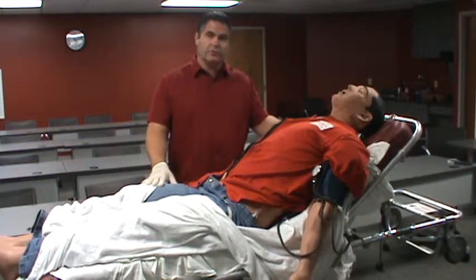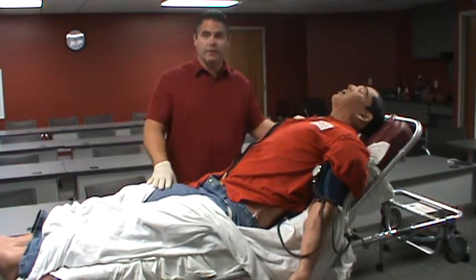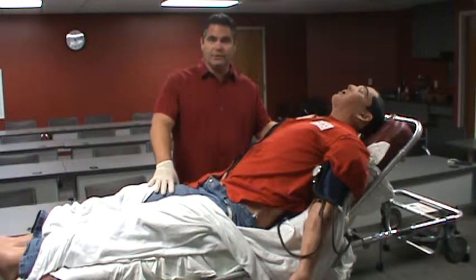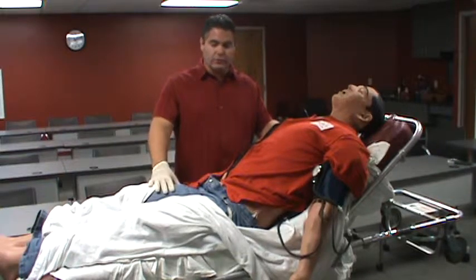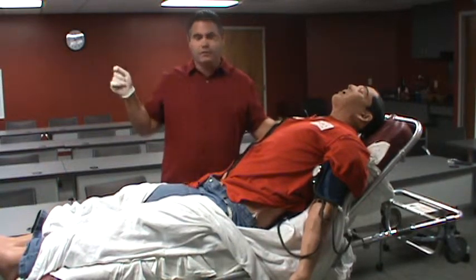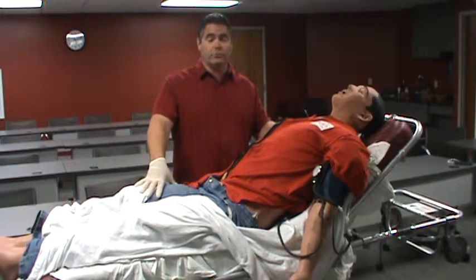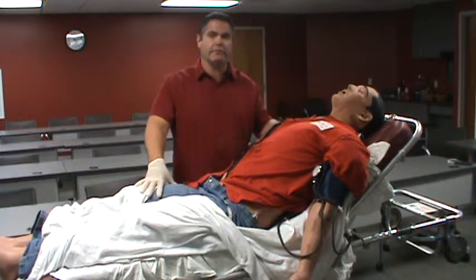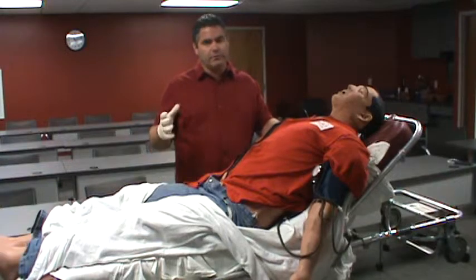If there's ever a question in the middle of a simulation, please just ask — we'll tell you if you can obtain it from the simulator or if we have to give you that information. This simulation process is high-fidelity, meaning it's real time. It's not like an ACLS course where you say a drug is given and move on. You give the drug and the body will respond appropriately. If you say you'd get another set of vitals, you're going to take another set of vitals — we're not going to give it to you. It's all real time, and that's part of the learning process.